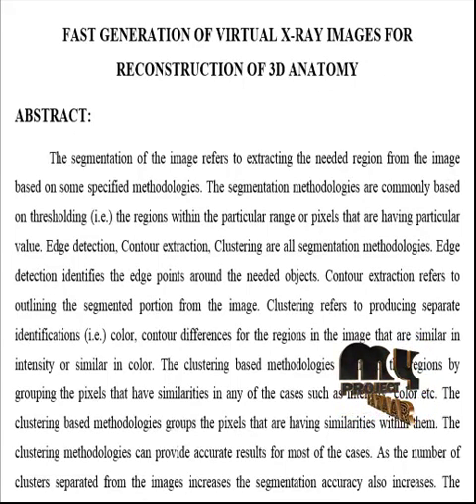Finally, the performance of the segmentation process is measured. As the performance strategy, the accuracy of the proposed method is calculated. The calculated accuracy and other performance metrics show that the accuracy of the proposed system is increased compared to the existing methodologies, since the proposed FCM based method is an automatic clustering based methodology.